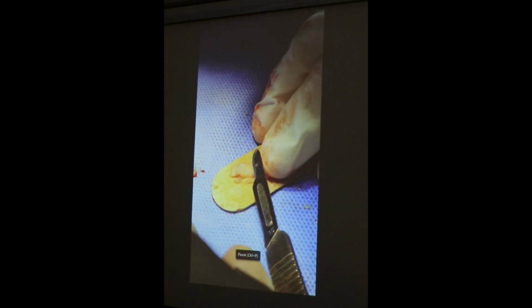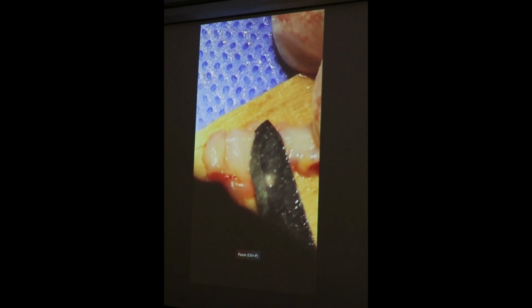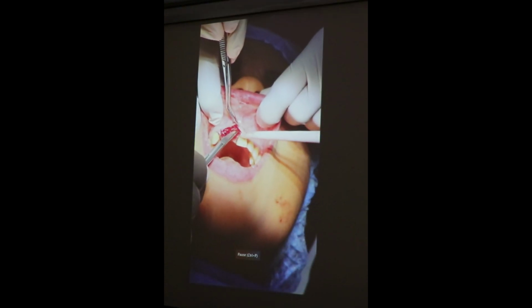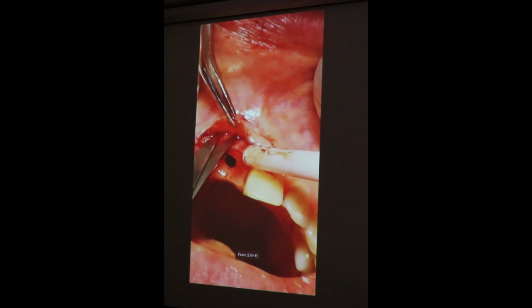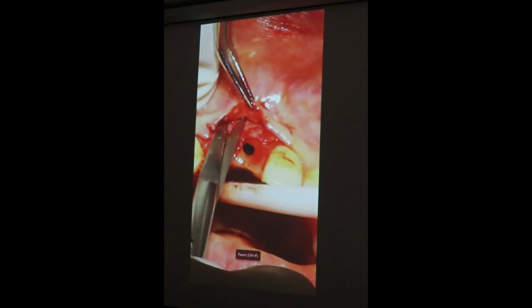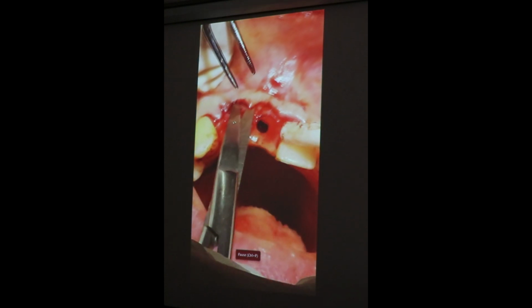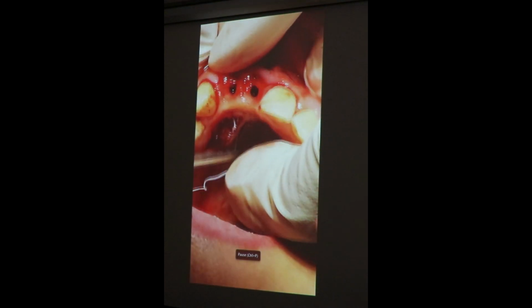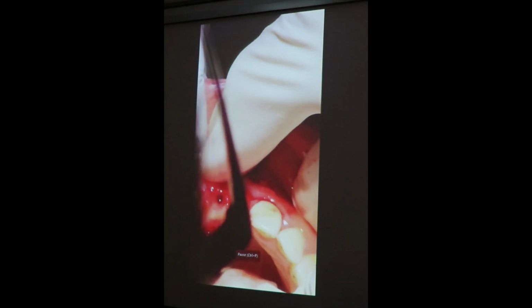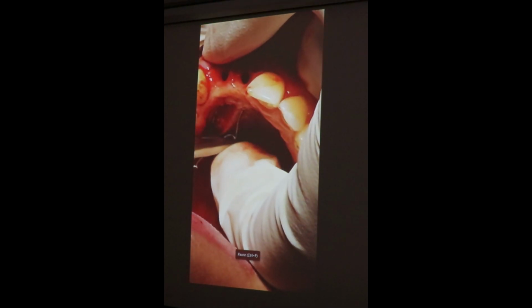So we removed the gingiva palatally, but now we are shaving the epithelium because epithelial cells will definitely not heal when it's embedded inside the soft tissue. Now, what is this, Zucchelli's technique, versus what is the other way? Well, the other way is to go all the way and touch the periosteum and remove your gingiva. In this technique, you only go 1 to 1.5 millimeter maximum below the epithelium, or you collect the whole thing and then you shave the epithelium off.